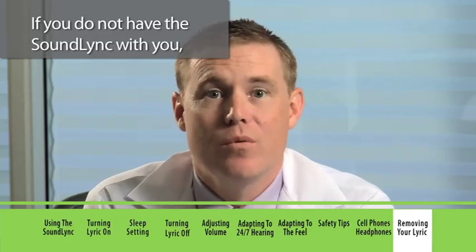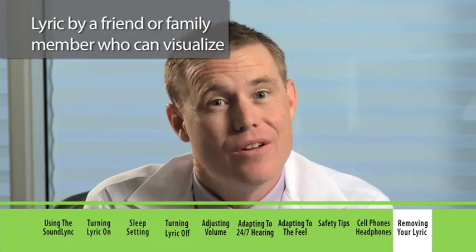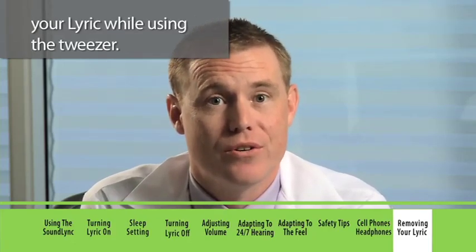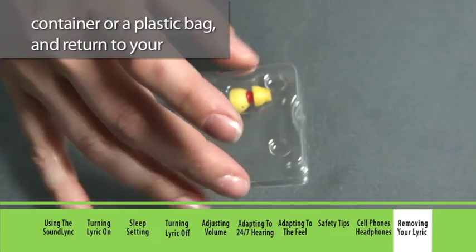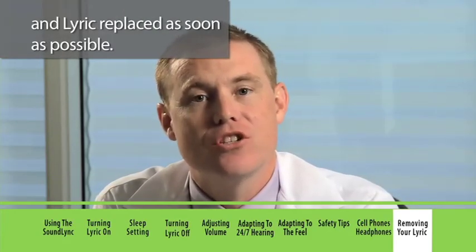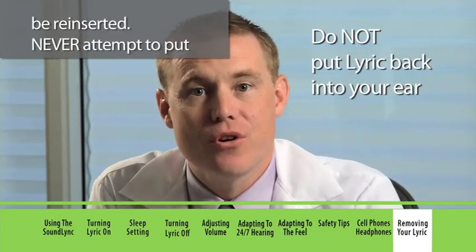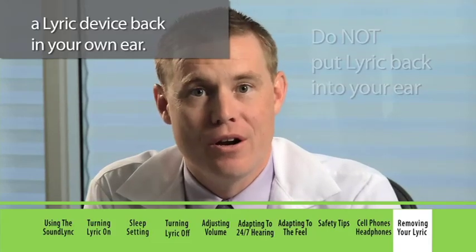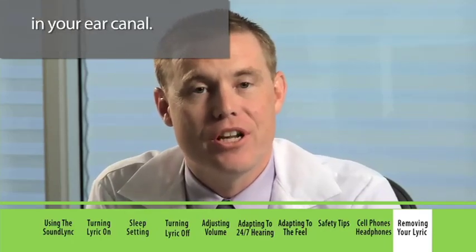If you do not have the SoundLink with you, a blunt nose tweezer could be used to remove Lyric by a friend or family member who can visualize your Lyric while using the tweezer. Once removed, put your Lyric in the provided container or a plastic bag and return to your hearing professional to have your ear examined and Lyric replaced as soon as possible. Remember, once you remove Lyric it cannot be reinserted — never attempt to put a Lyric device back in your own ear. Only your hearing professional is trained to place Lyric in its safe and proper position in your ear canal.